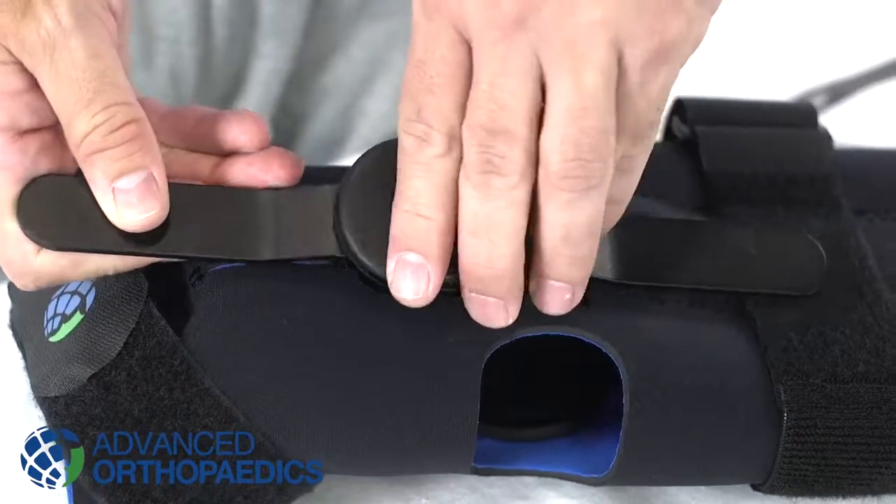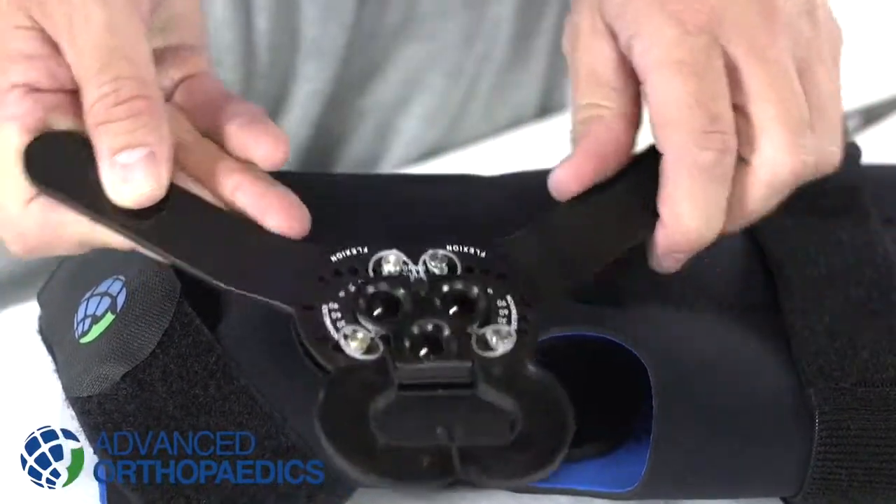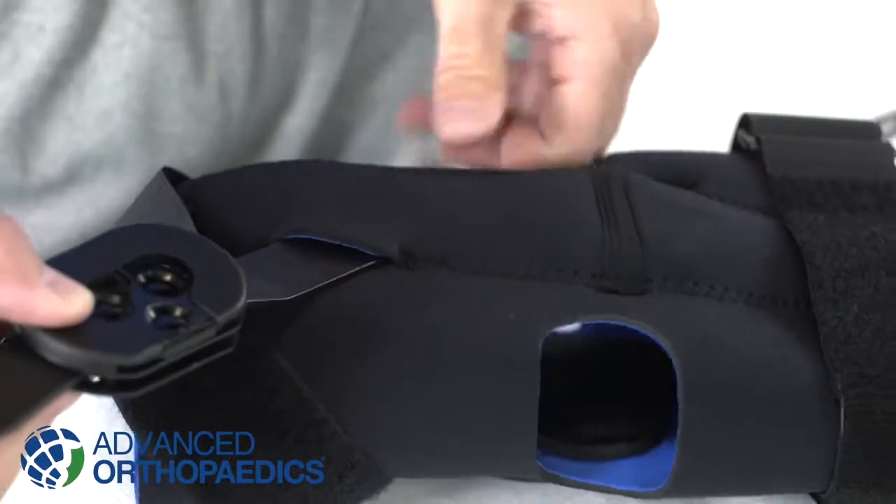Set the range of motion in each hinge to the desired level of flexion and extension, then reinsert.